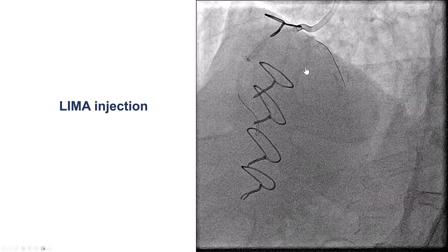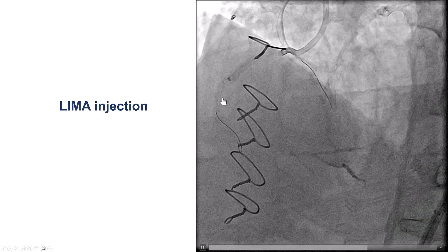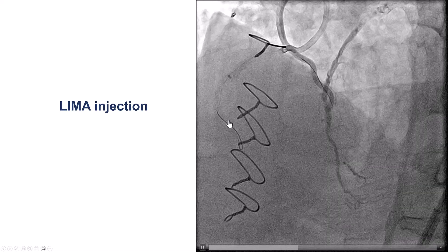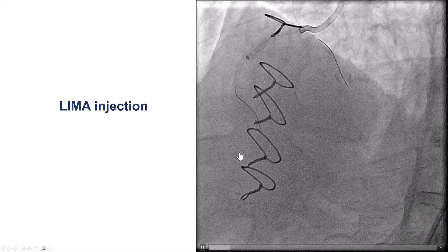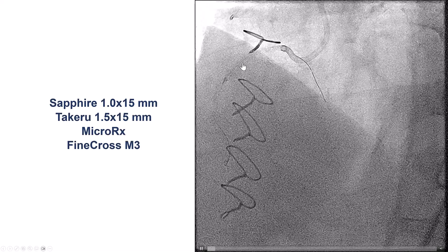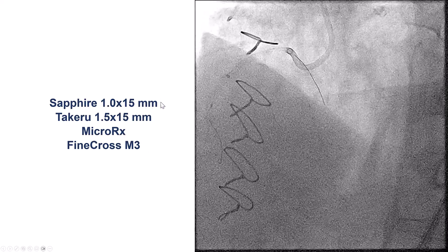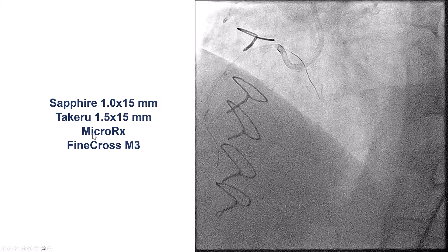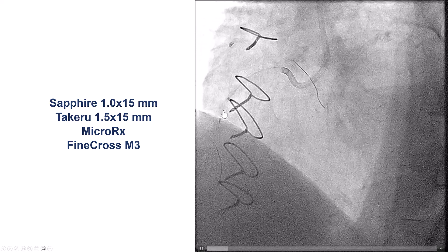We repositioned the guide and had the guide extension come further down. With injection through the LIMA, we saw that the guidewire was dancing along the vessel and was probably inside an acute marginal branch. We tried the Sapphire 1.0 mm balloon — that did not work. We tried a 1.5 mm Takeru, and the one that went furthest down was the Micro RX. We also tried a Finecross M3, but nothing would cross through the proximal right coronary artery.